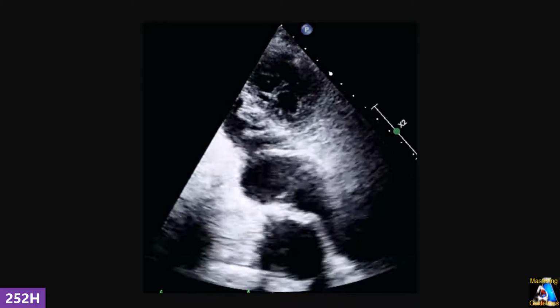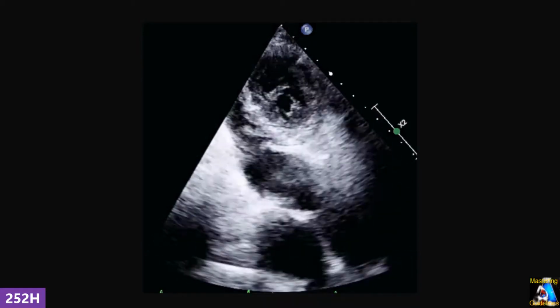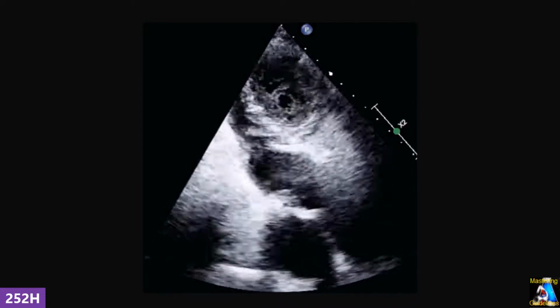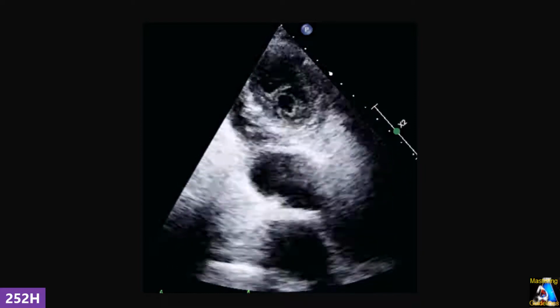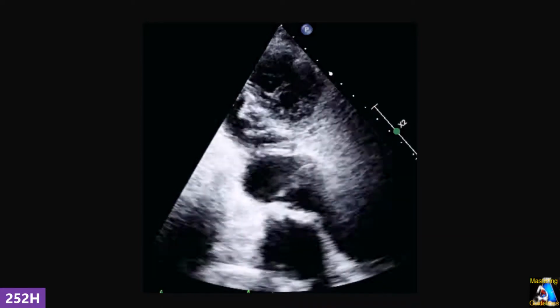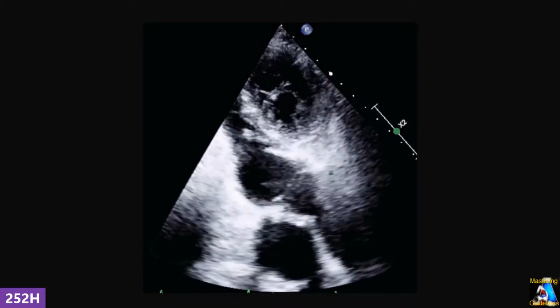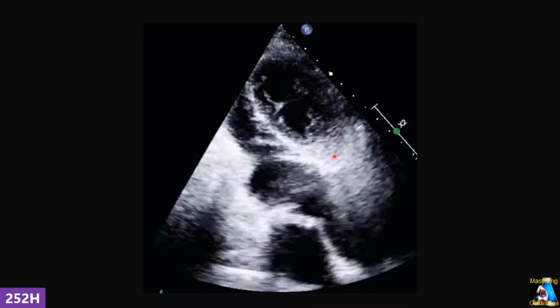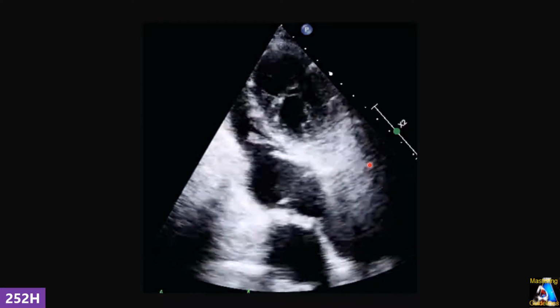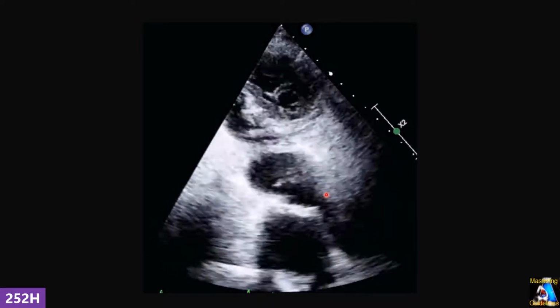You have a challenging patient, and you go for the apical 4. You search everywhere. You cannot find the apical window, but suddenly during this searching, you get this view. First of all, what is this view? Second, with only one maneuver you can get the apical 4. What maneuver from this view will be?